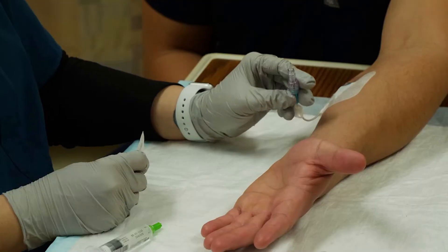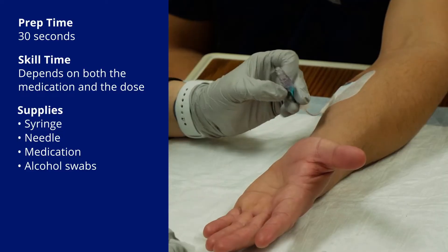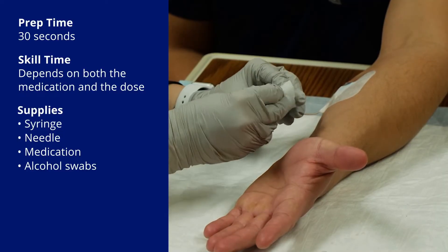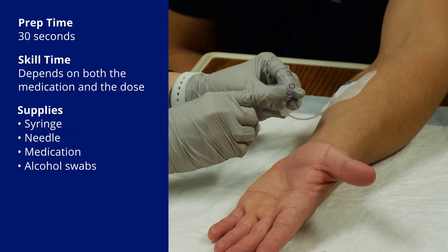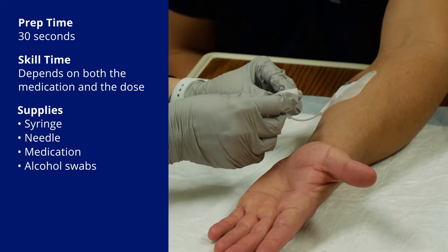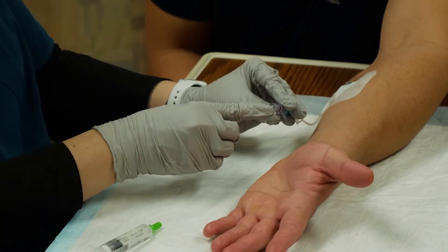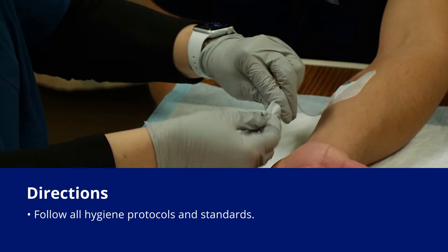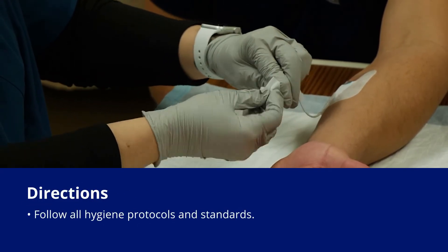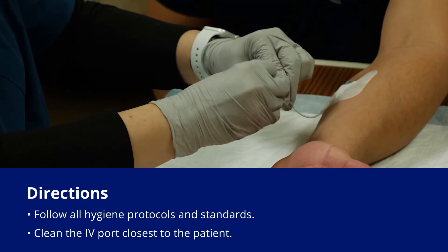Some institutions have a little disinfection cap that sits here, but he doesn't have that. So I'm actually going to take out my little chlorhexidine wipe — alcohol is fine too. I'm not trying to scrub the area around it at all. This part right here is a little plastic piece that actually holds lots of germs, so that's the part I'm really trying to get my thumbnail in there and scrub. Then I'm going to also clean around the edges.